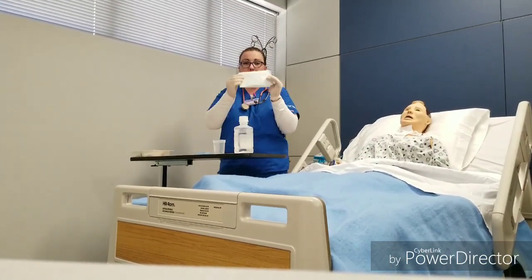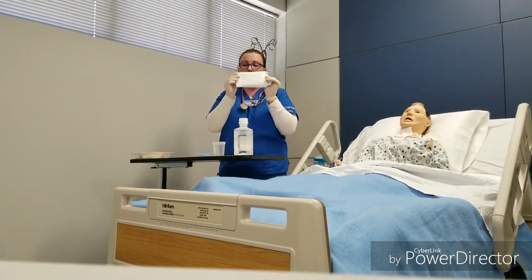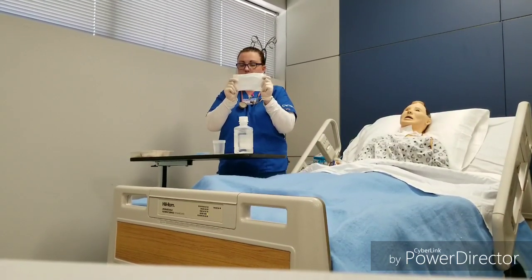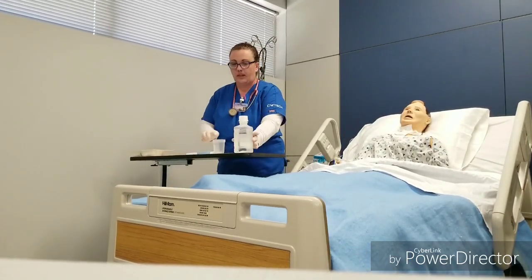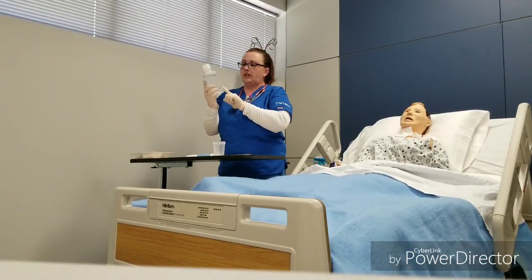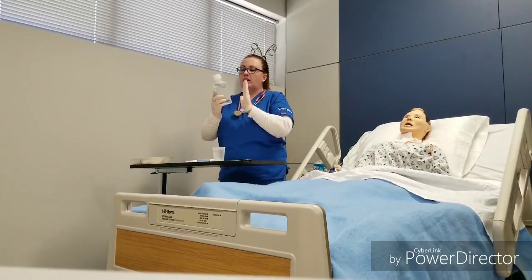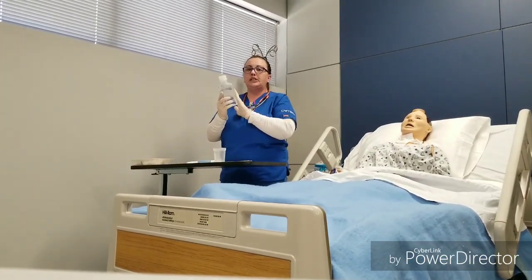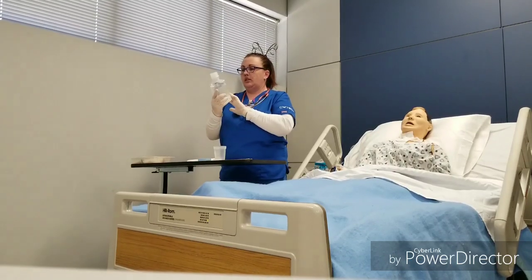And we're going to pretend like this is a sterile package that I'm opening, a new sterile suctioning device. But it's not, just know that it's not. This is your saline, same thing applies. Check the expiration. If it's not new, you need to label the bottle. If it is brand new, then you need to date it and time it for when you opened it.